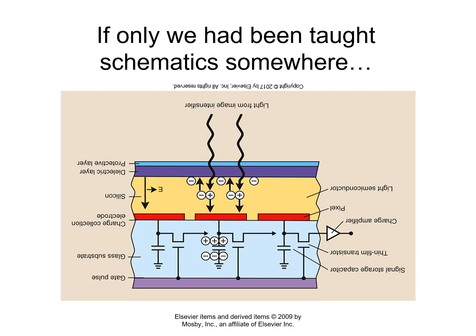And you see down here where it says gate pulse, it's upside down, it's in the bottom purple section. That's an independent circuit that is providing control to the gates. If we turn the current on for the gate pulse circuit, then the gate swings open and those positive ions can move through the gate, okay? And so they will move, in this diagram, they will shift to the right, okay?